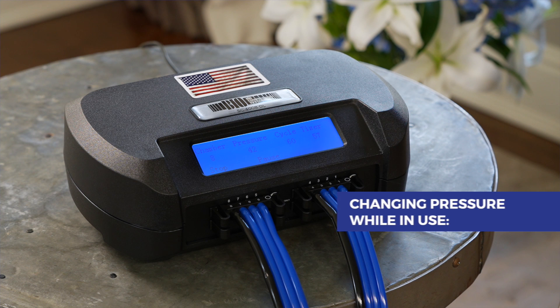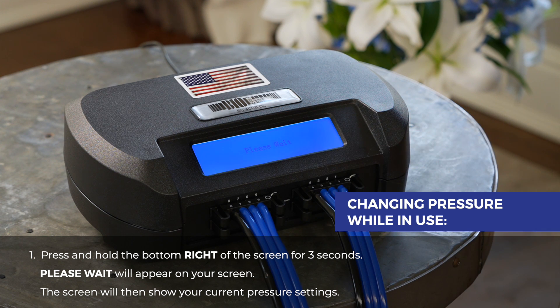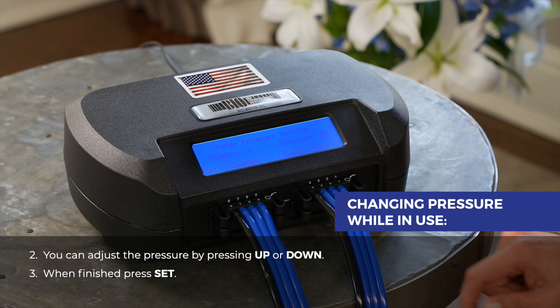To change the pressure setting on your pump while in use, press and hold the bottom right of the screen for three seconds. Please wait will appear on your screen. The screen will then show your current pressure settings. You can adjust the pressure by pressing up or down. When finished, press set.